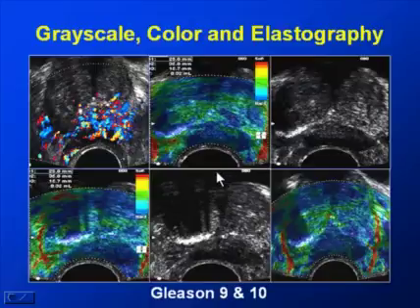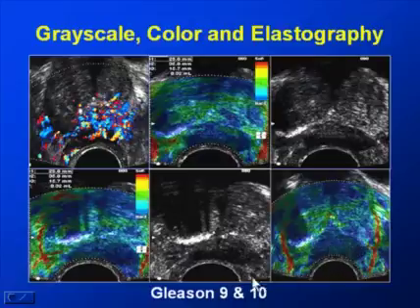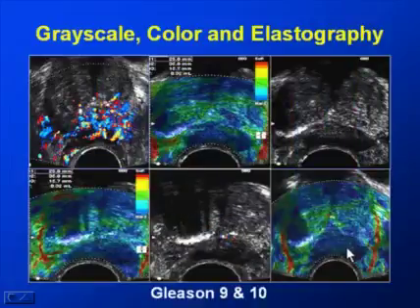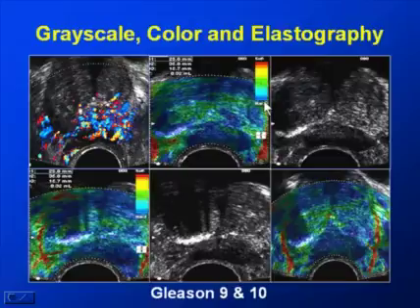If you compare examples of cancers detected with elastography, you can see here Gleason 9 and 10 prostate cancer that were also found in this mode and in ultrasound imaging. And you can see the lesion is here. So you can see it's much stiffer than the surrounding normal tissue. Again here, contrast this to the previous one where there was a clear mixture of red and blue and green, but now it really only is, more than anything, a larger red area indicating stiffness. You can see the relative lesion up here, on a scale from soft to hard.